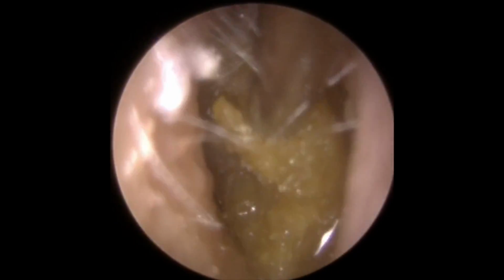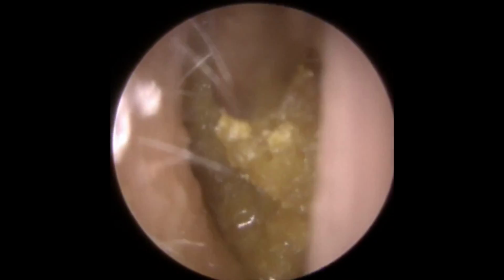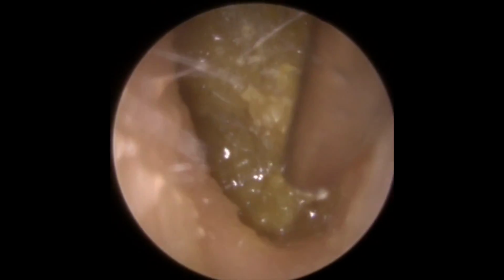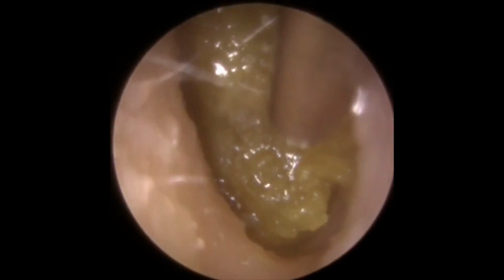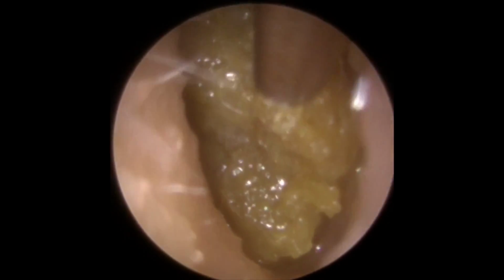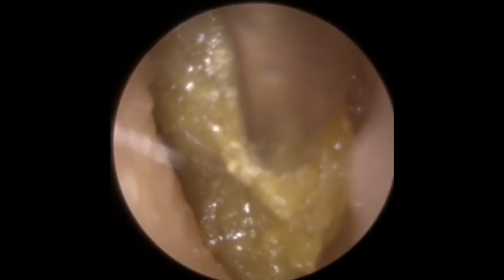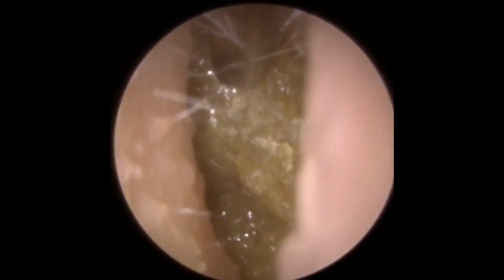So I've popped a little bit of olive oil in here, for two reasons. It's going to help us to get a hold on to this wax a little bit better. It's going to lubricate the canal wall, which is going to make it more comfortable for the patient, and we've got a better chance if we can get a little bit of a grip of this sliding, using the oil to slide out of the canal. Now you can see we're bringing it back around again, trying to get it to that front section of the canal, just really giving this a wiggle up and down.